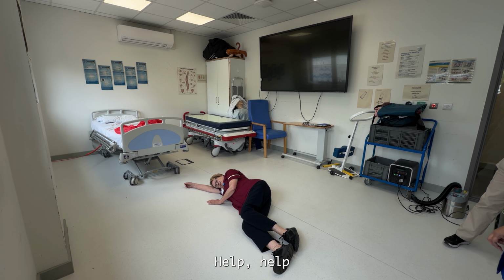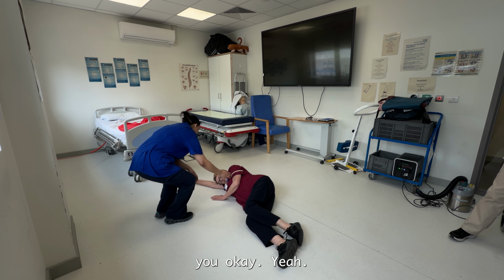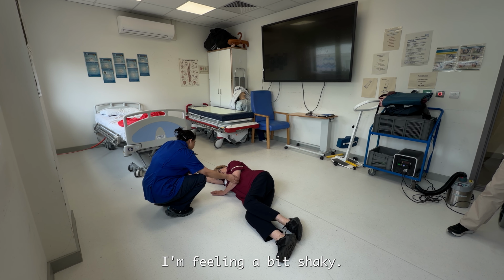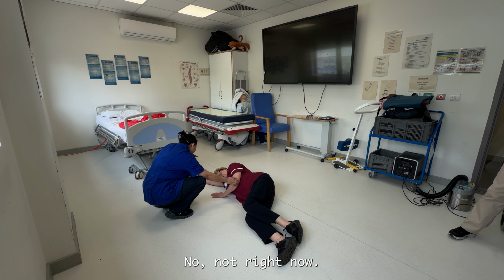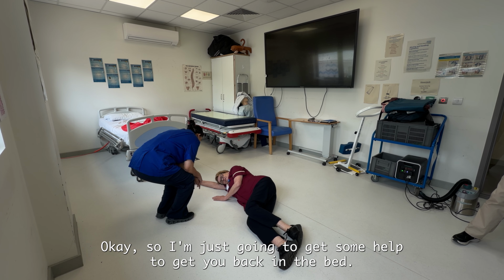Help! Help! Sharon, you okay? Yeah, I fell while using the frame. Did you hit your head? I didn't hit my head. I'm just feeling a bit shaky. I don't think I'll be able to get up by myself. Do you have any pain anywhere? No, not right now. So I'm just going to get some help to get you back in the bed, okay? Okay.